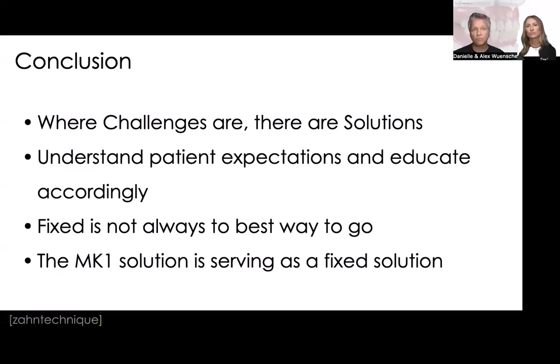If we just follow the patient blindly, oh, you want to fix, no problem, we're going to make a hybrid, without actually consulting with the lab or, as a surgical clinician, with your restorative dentist or with a prosthodontist, and don't give that patient other options, we may end up in a dead end, right? So we really have to understand where these patients are coming from, why they're here, where they are right now, and where they want to go as a final. That's very important.